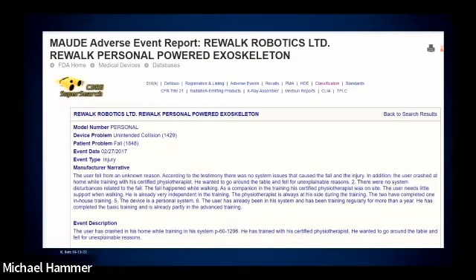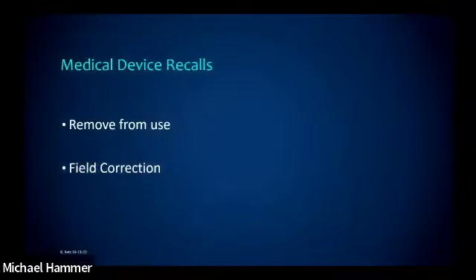So a phone call is one thing. Talking to your manufacturer's representative is a conversation. If it's not documented, it didn't happen. So I recommend, just to get the information logged appropriately, communicating by email at minimum and documenting in the database, so that those pieces of information are recorded. Maybe nothing will come of it, maybe it was user error, but that requires an analysis to determine what the cause of the adverse event was. So that gives you an example of how that goes in and empowers us with information. When someone says, we've never heard of that before, it's like, yes, you have. So we're entering that information.